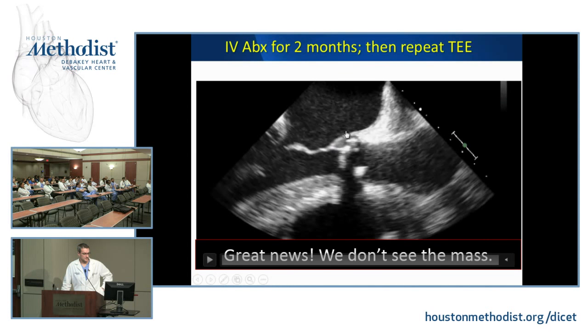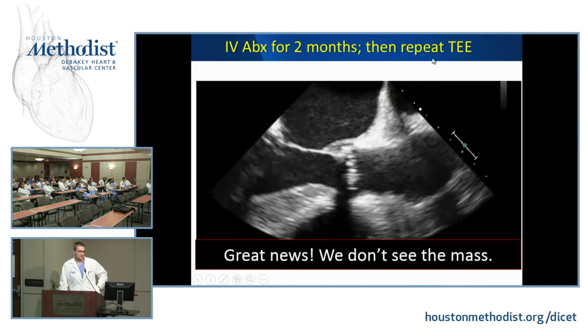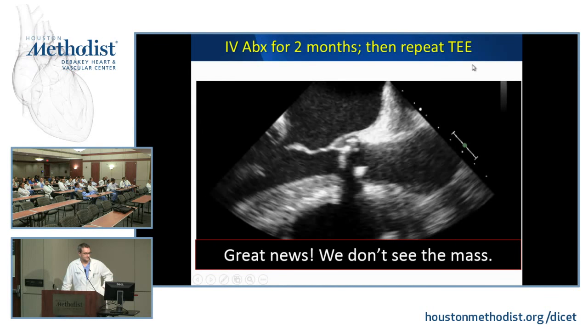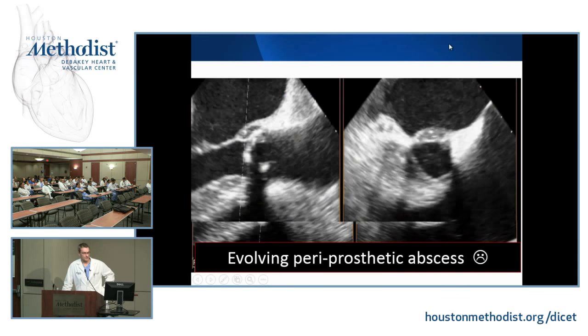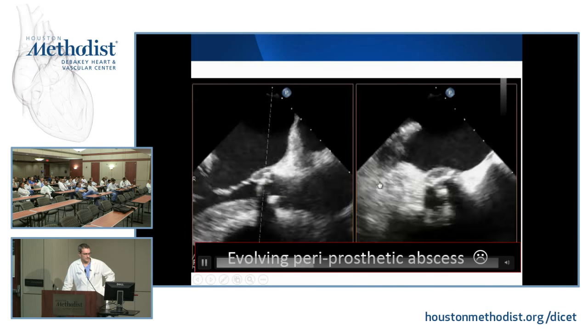Well, now we got this. This was 2 months later. So now he's got this. That's concerning. And you know, this is an evolving periprosthetic abscess. And that's the classic feature.